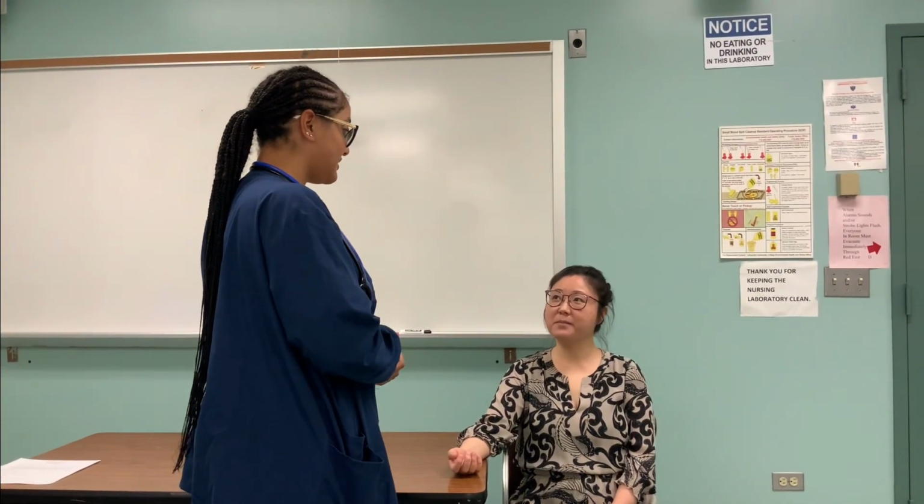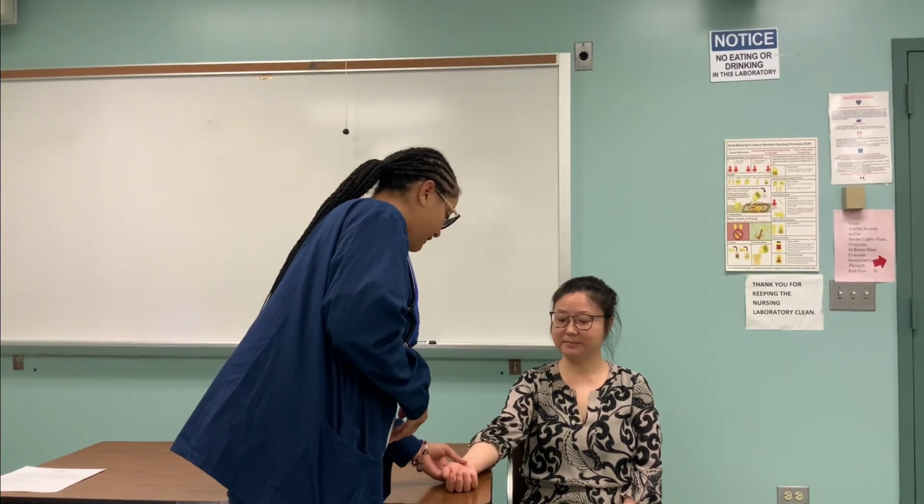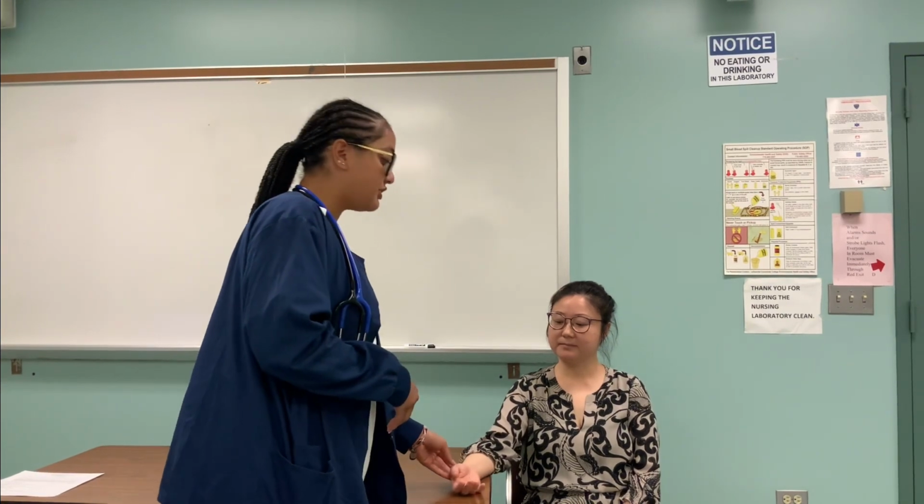Yes, I'm Ms. Duan. My date of birth is January 1st, 2000. And then you would confirm by looking at the wristband. And then you want to always announce what you're doing. So you'll tell them, I'm here to take your vital signs.